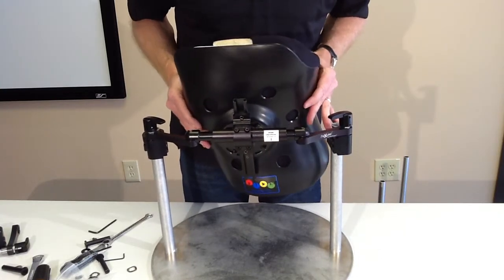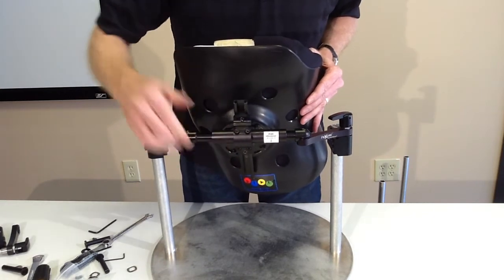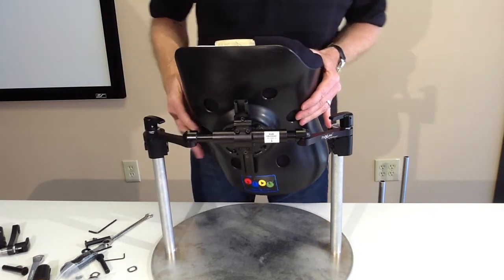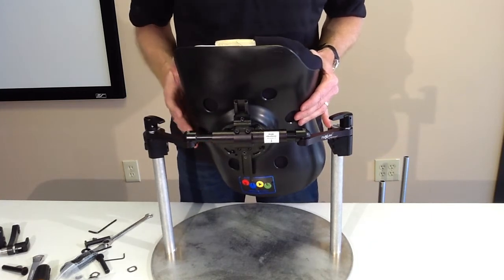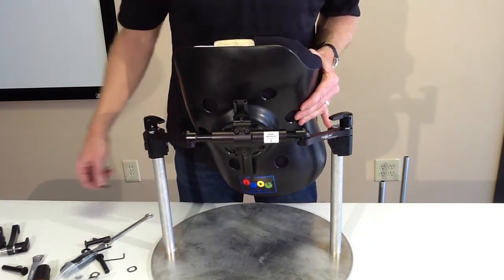Now let's just say I just discovered that this feels like a good sweet spot to start, right here. So somebody's holding the client from the front with the back support possibly, and it's now time to tighten things down.